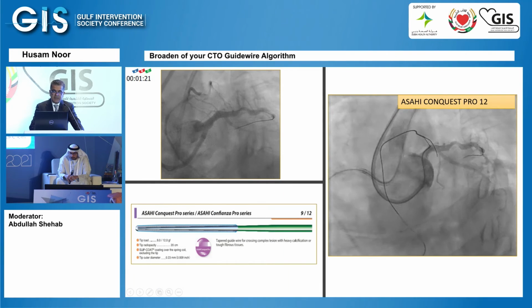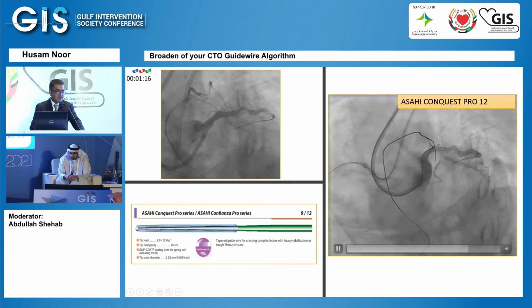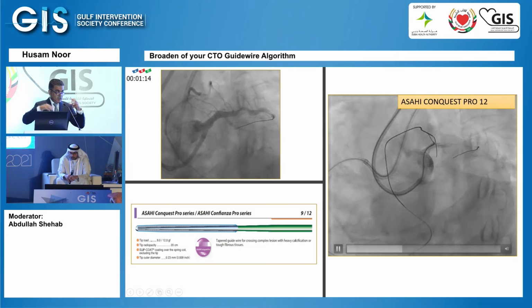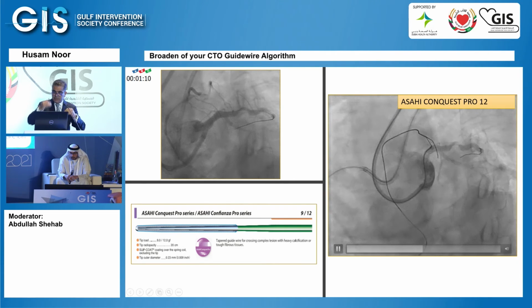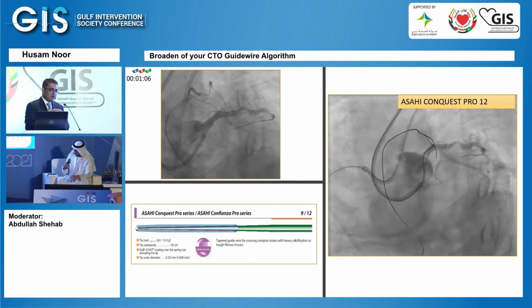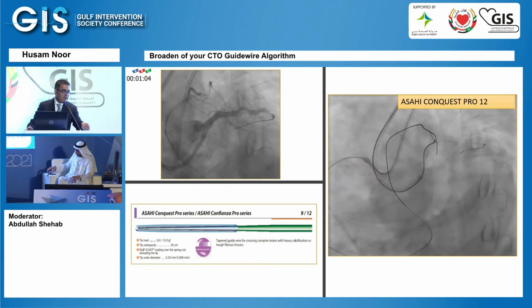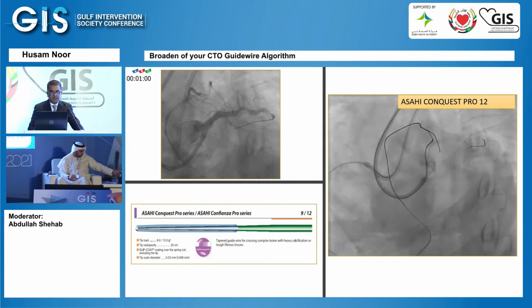So now you can see I'm at purchase. These two wires are close in terms of proximity. You look at it in different angiographic views, make sure that these wires are dancing with each other. Now I'm pretty much confident I'm in the vessel architecture. I don't care whether I'm in the lumen or in the wall, as long as I am in close proximity.